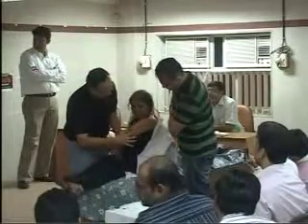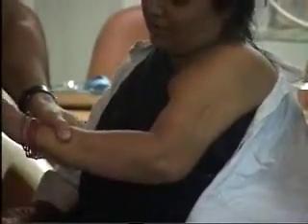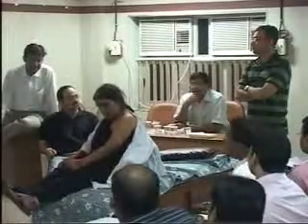What is this? There is a scar. Okay, what is this? Very good cases. One scar, two scars. What kind of scars do you think are these? Somebody has put nail. So somebody has done Enders probably. That is the only answer. Open reduction. Unfortunately, she has no risk. How many years has it been? Fifth year. So, no diagnosis. You don't need history. You keep your eyes, ears, and brain open. X-ray.